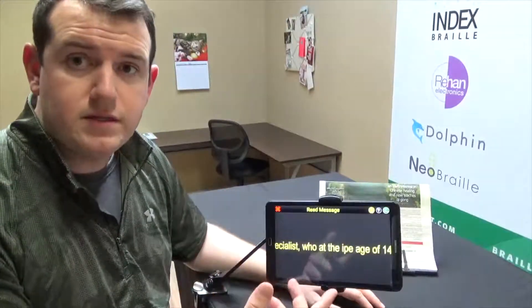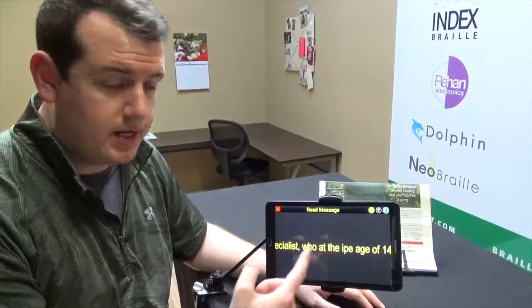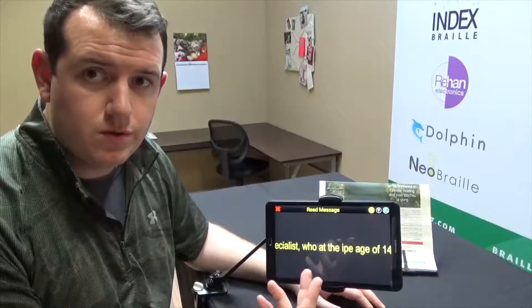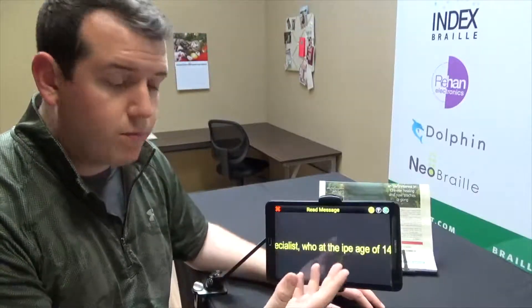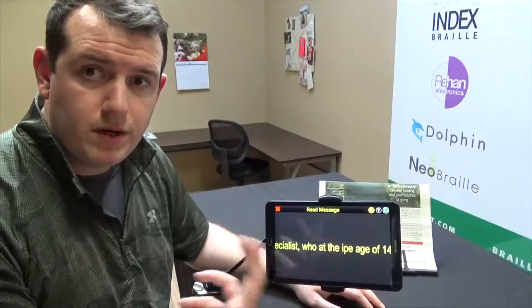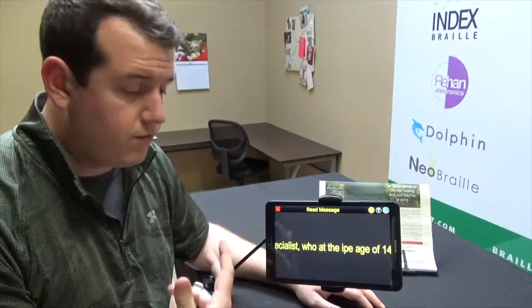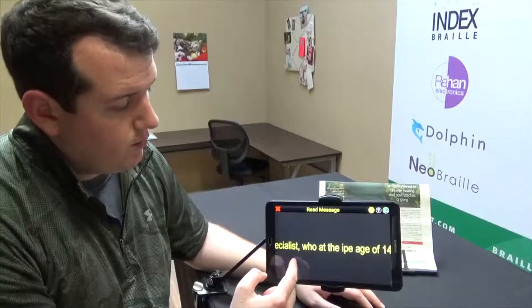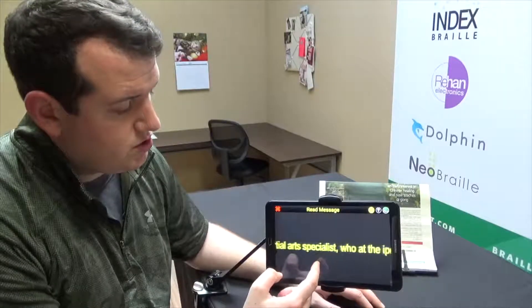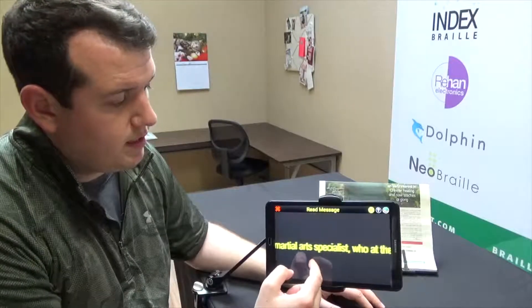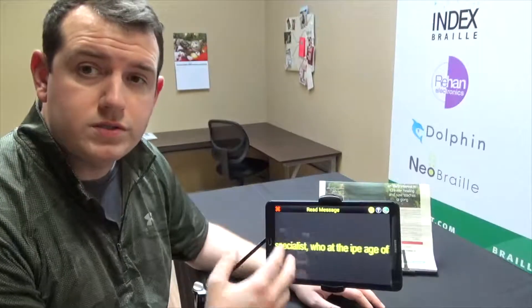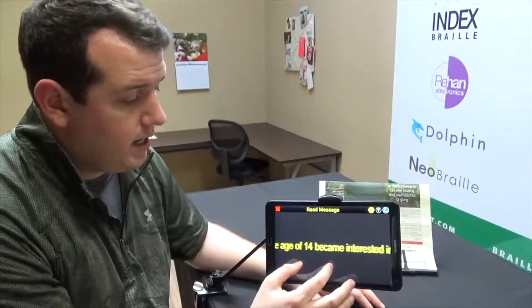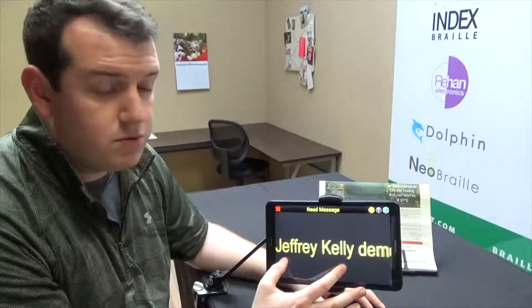The last time I used this I had it in Line View, which is one of the ways you can read it. It remembered I was using Line View before and brought that right up. In this mode, you can swipe on the screen and it will scroll across for you so you can read as you go. You can also pinch and zoom to make the text larger.